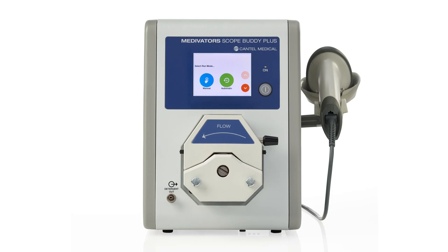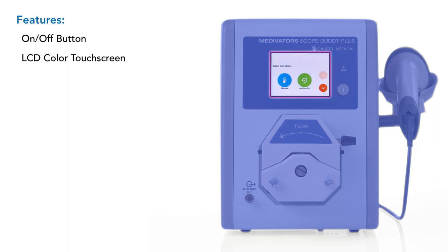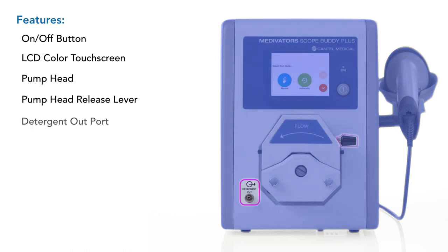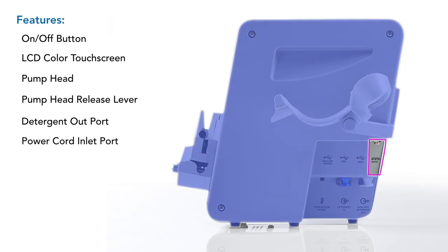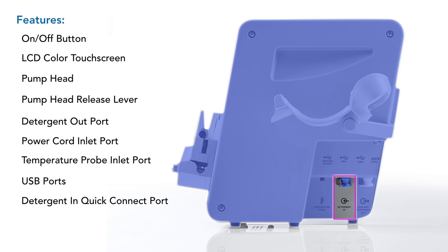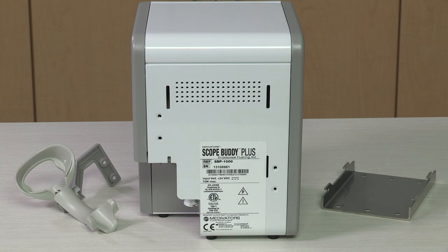The front of the Scope Buddy Plus Flushing Aid includes a power button, LCD color touchscreen, pump head, pump head release lever, and a detergent out port. The right side includes a power cord inlet port, temperature probe inlet port, three USB ports (one for the barcode scanner), detergent in quick connect port, and an auxiliary detergent out quick connect port. The back of the device has slots for wall hanging with the provided bracket. The barcode scanner bracket can be mounted on either the right or left side of the unit.